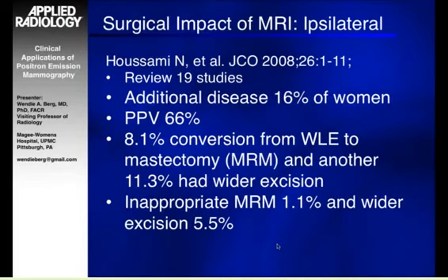But unfortunately, there was also an inappropriate rate of mastectomy in 1% prompted by the MRI, and excessively wide local excision in another 5%. This highlighted the need for a more specific test that would be less likely to prompt unnecessary surgery and especially unnecessarily harsh surgery. And this really was where the interest in looking at PEM for this purpose came about.